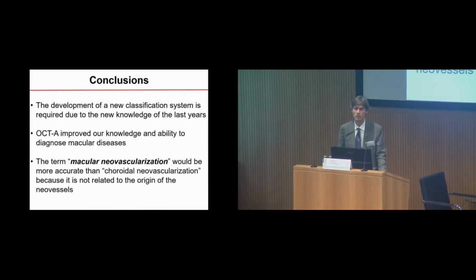So in conclusion, thanks to multimodal imaging and the introduction of OCT-A, we may give new names and also better interpret the progression for the different subtypes of neovascularization, and possibly in the future it will be one of the main tools for diagnosis and following patients with neovascular AMD.